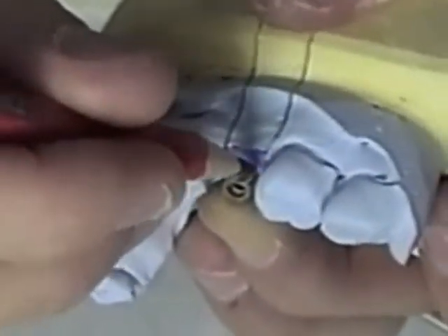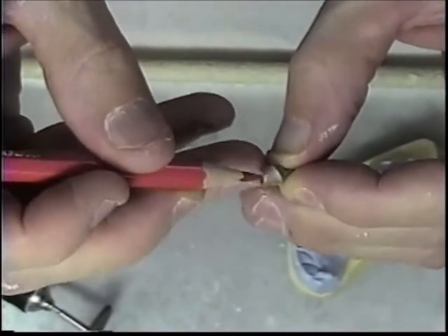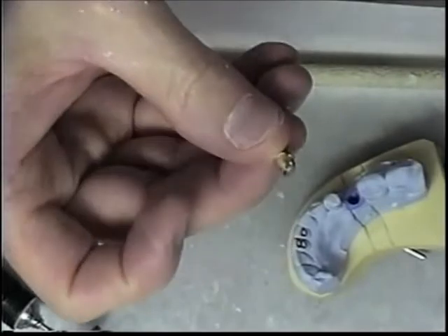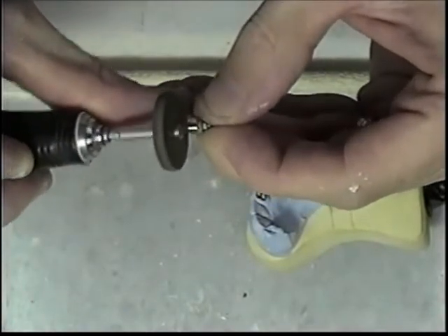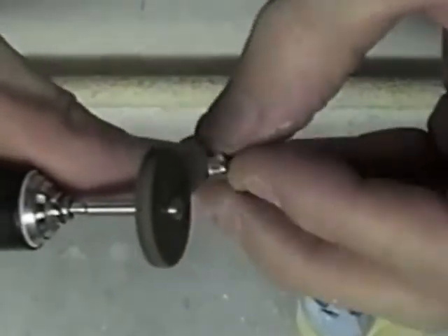My real focus is really making sure that the margin here is subgingival, not necessarily the lingual, but I'm going to go ahead and start doing some of the modification now. As I create my margin and make it more distinct with my high speed, I'm also concentrating on making sure the overall abutment is not going to be undercut and will allow me to draw my coping. Another way to shape the abutment is by using a rubber wheel, which you can also use to create your margin.